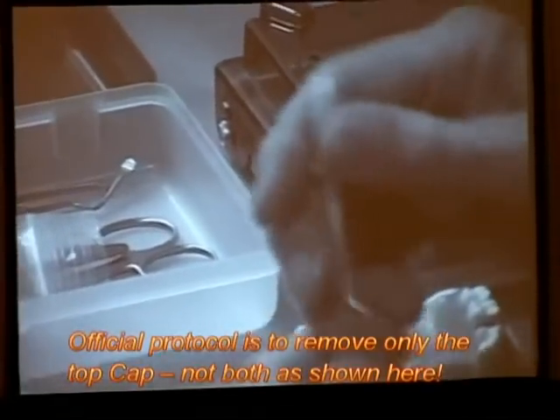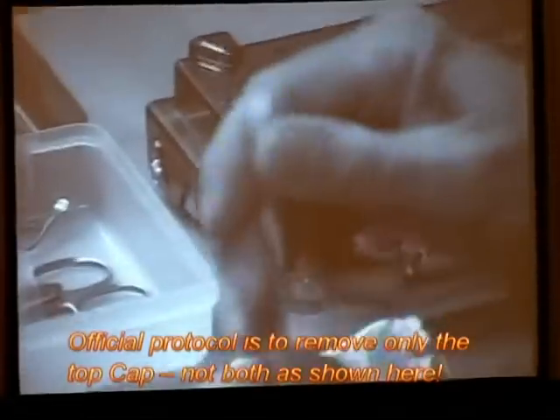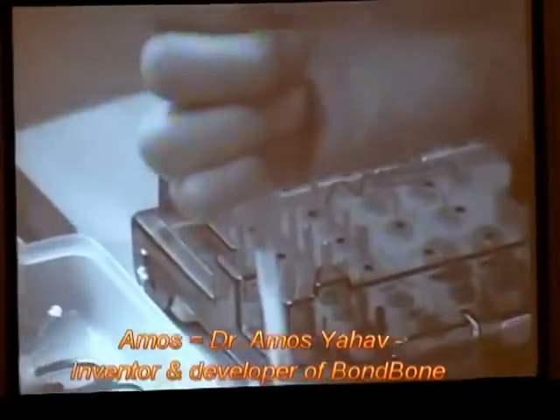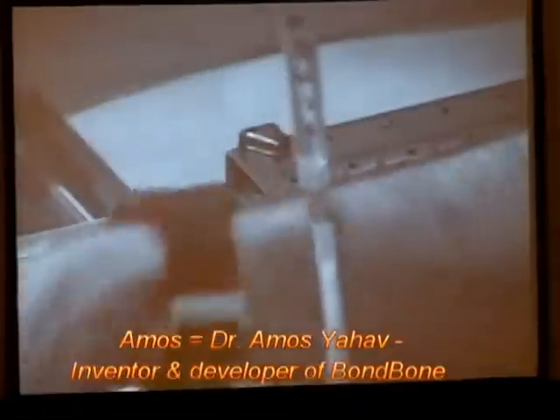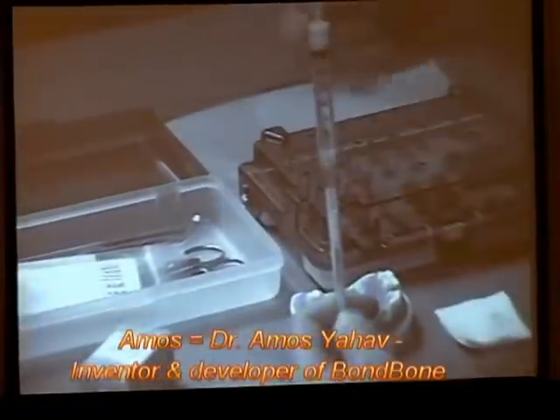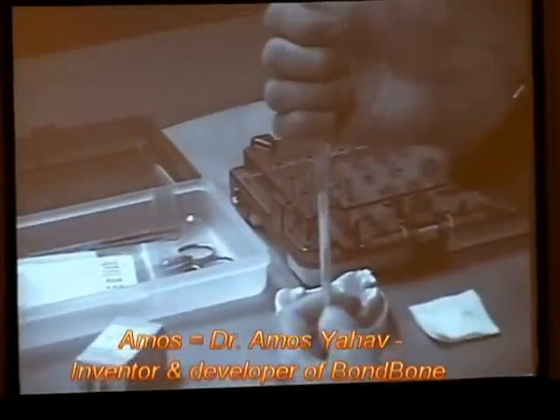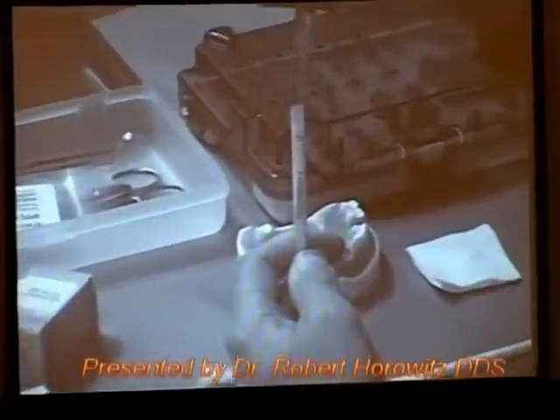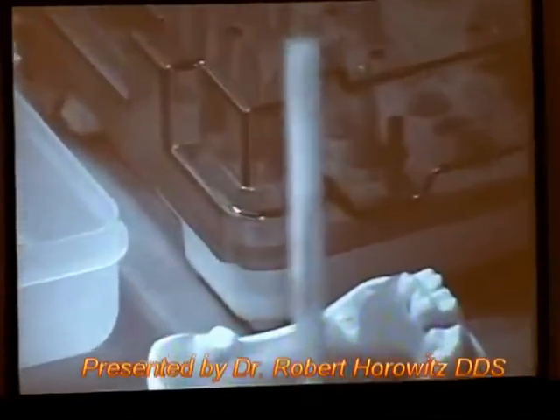With it vertical, we're doing it Amos' way. We're going to take the syringe of sterile saline — he uses anesthetic. And you're going to very slowly fill up the entire way with liquid until it's all the way to the top.